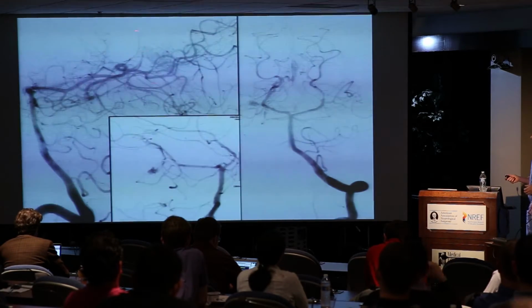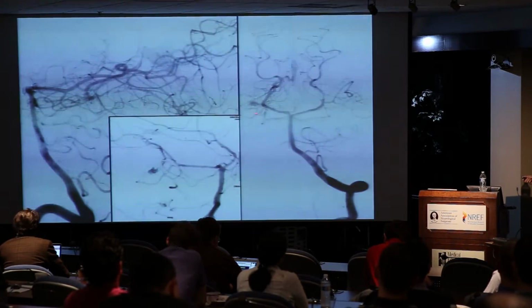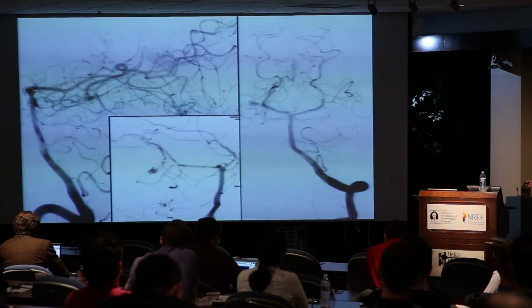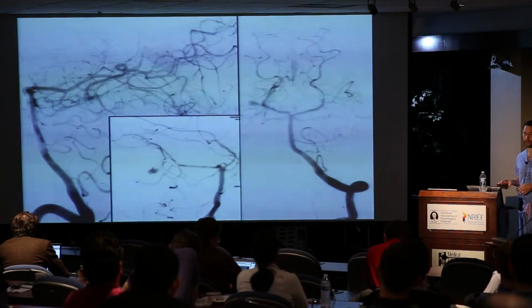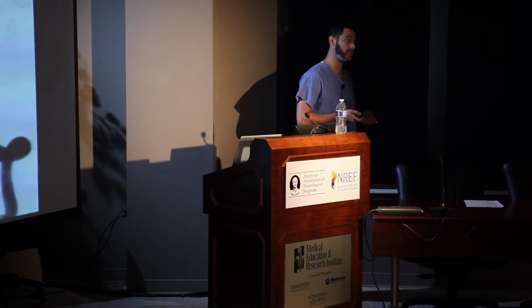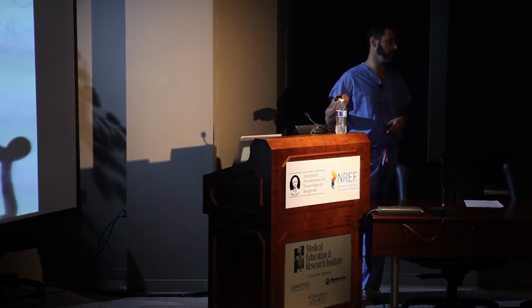So it's hard to see. You can see the straight sinus. It's early. You can see it here too. Now you see this little tiny, I don't know the proper measurements for a micro-AVM, but this is small. But this is also associated with a hematoma. I may not be seeing the whole thing angiographically. To me, that's another reason to wait.